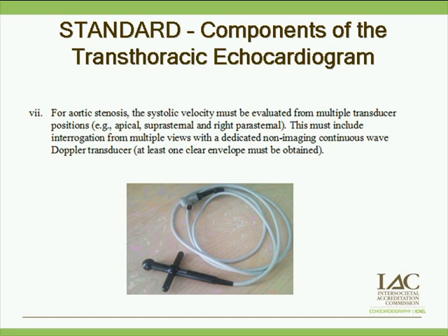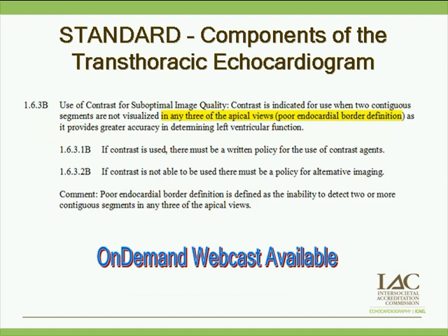So what you have to do is go ahead and use that PEDOF or dedicated CW probe from multiple positions. So use it from the apex. Use it from the suprasternal notch. Turn your patient, get that right sternal border. But really, you have to use it because otherwise you're taking shortcuts. So again, go ahead and be sure to use it.